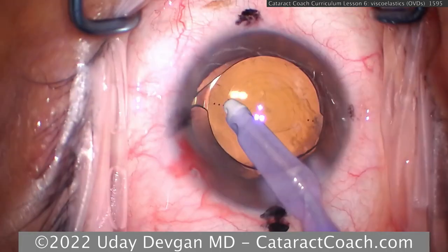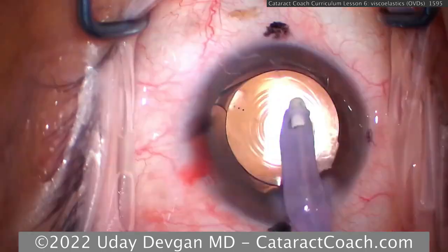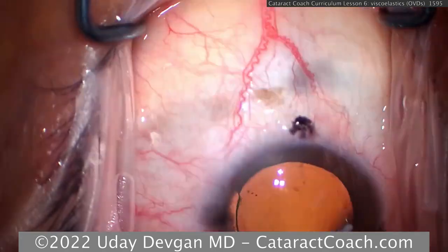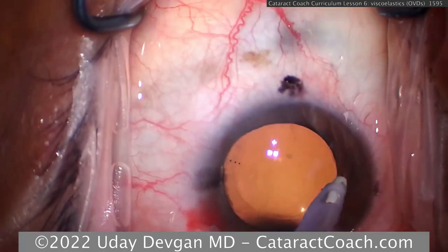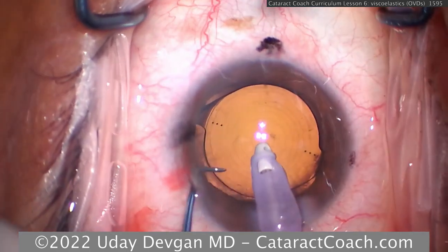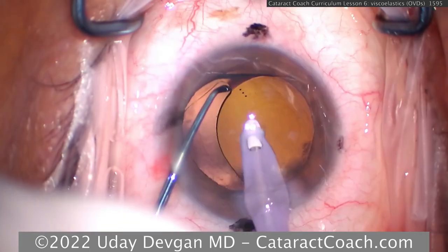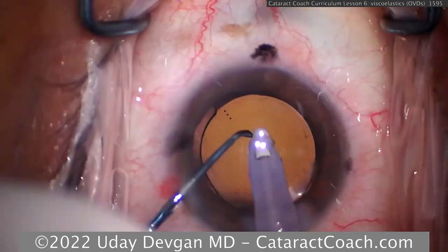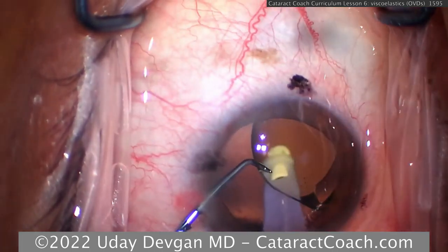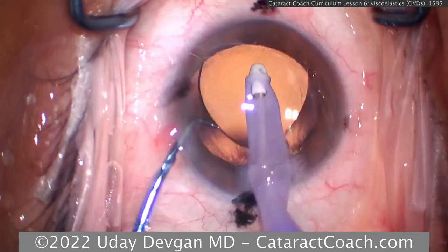So here, you look at the video, another trifocal and toric IOL that has to be placed at a very specific axis in terms of rotation, plus we have to center the diffractive rings with those Purkinje images. So in this case, it's absolutely critical that you remove the viscoelastic from behind the optic. So if you're going to do a toric lens, a diffractive lens, a multifocal lens, a toric multifocal lens, all those, it's very important to remove viscoelastic. If you're doing a monofocal lens, it's not quite as critical. You may have issues with IOP spikes right after surgery.